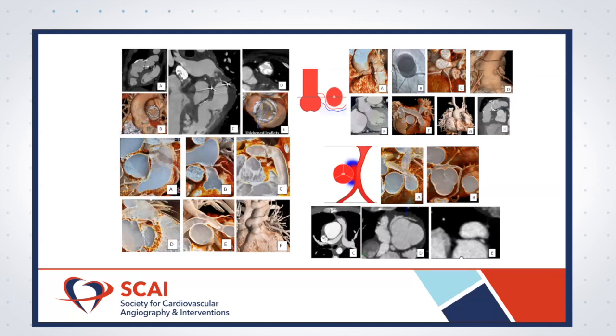So there's some patients where the proximal RVOT is widely patent and would be great, but like image B on the bottom left, you can see that the conduit is stenosed distally. And so I think you have to look at where is the landing zone for this patient and where is a coronary artery to make a very individualized assessment of coronary compromise.